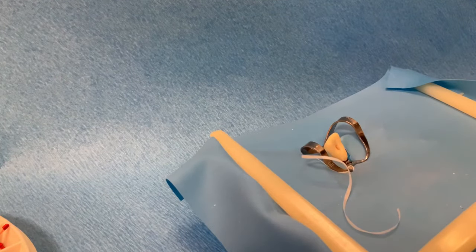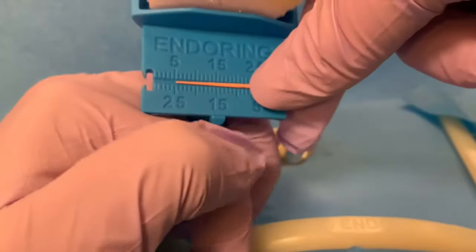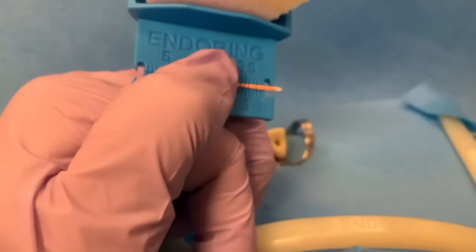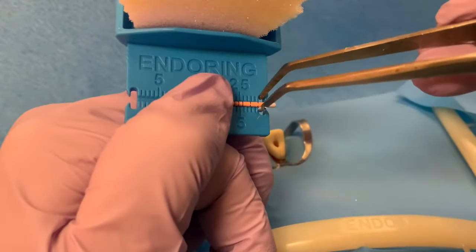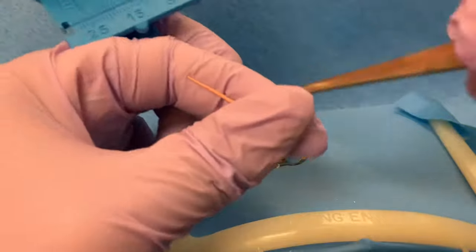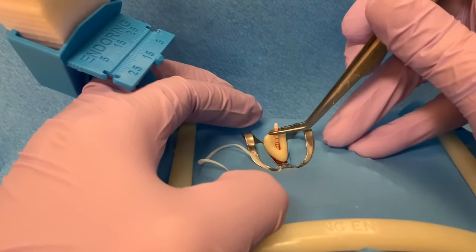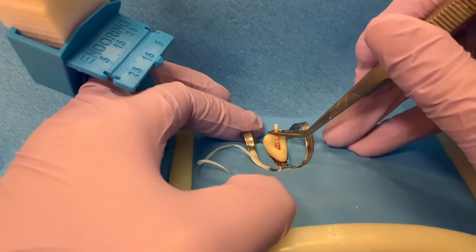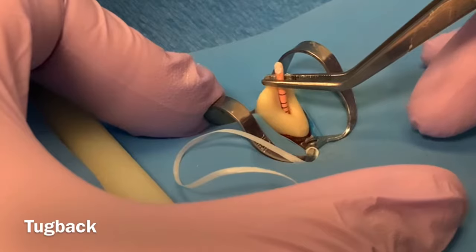Let's clean and shape with a size 45 file again, so that the 45 cone will go all the way to the working length. The size 45 cone now goes to the working length and has good tug back, meaning there is resistance when trying to pull the cone out of the canal.